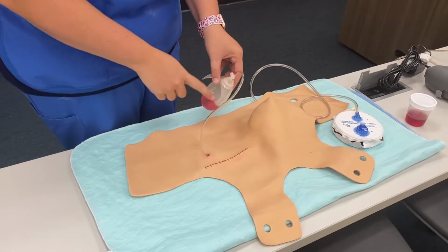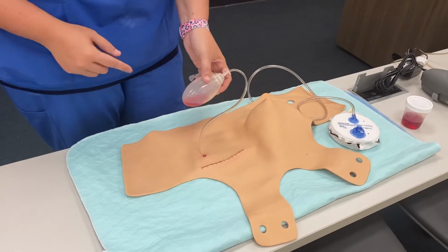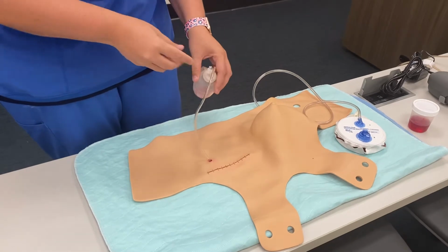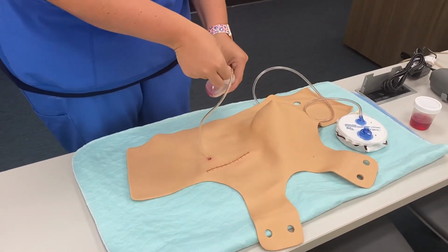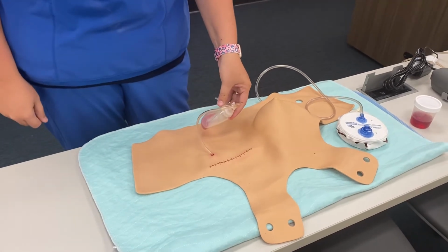If you ever go in and the bulb is not compressed, if it looks like that, there's no sucking going on, okay? No suction, so it's not doing its job. So you would want to re-compress it and close it back to make sure that it's working properly.